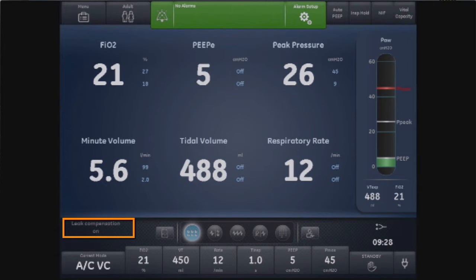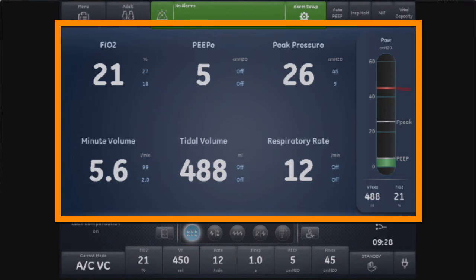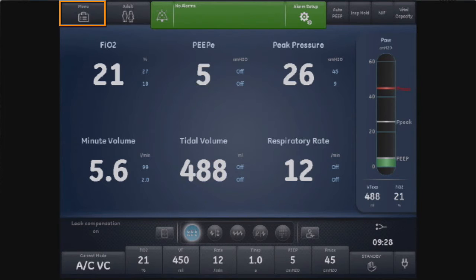The general messages area of the display shows notices, procedure status, and system status information to the operator. Monitoring. This area is used to view waveforms, measured data, and settings. The menu key. Select the menu key to quickly access options such as System Menu, Procedures, Lung Mechanics, Suction, and Nebulizer. The Current Patient menu key is used to enter current patient data.